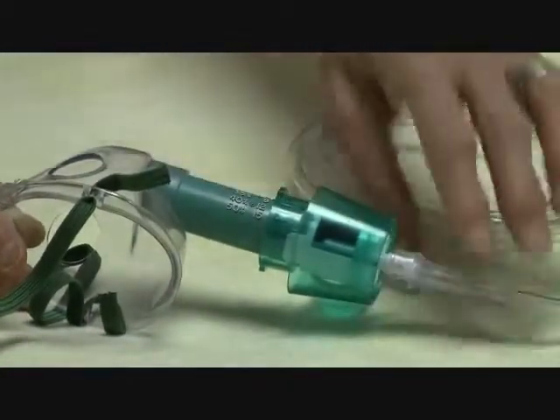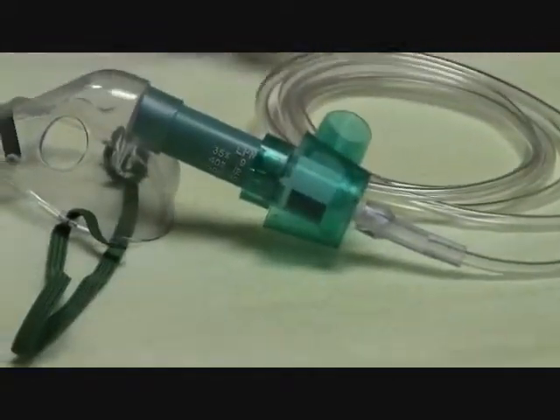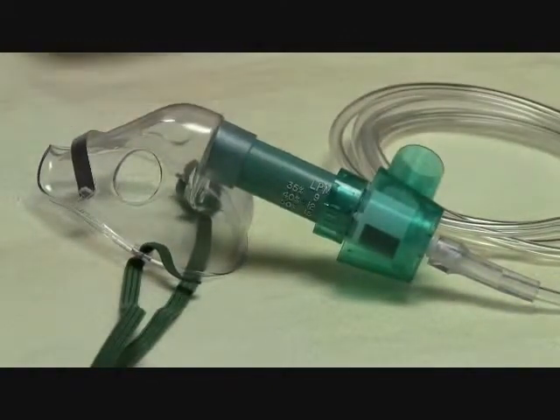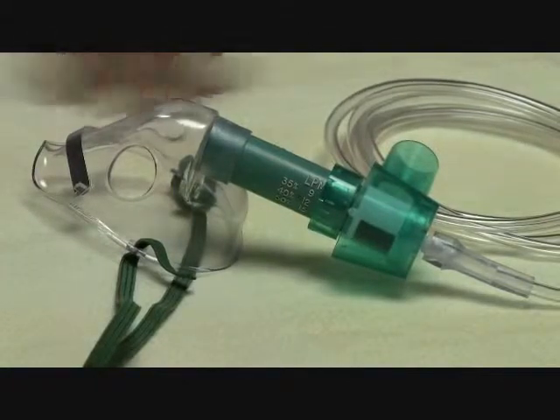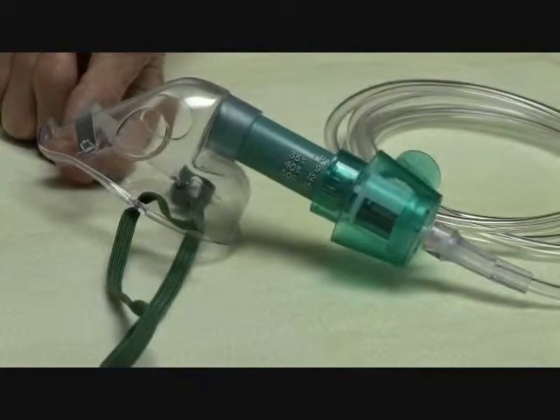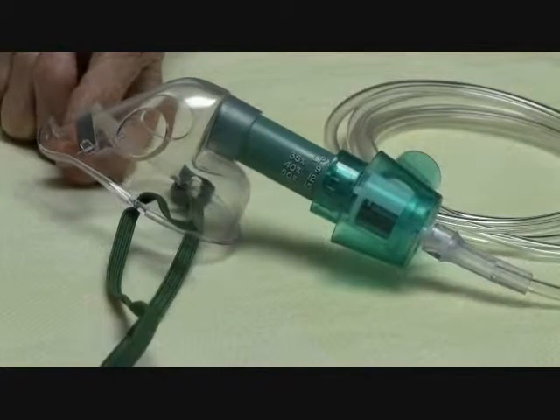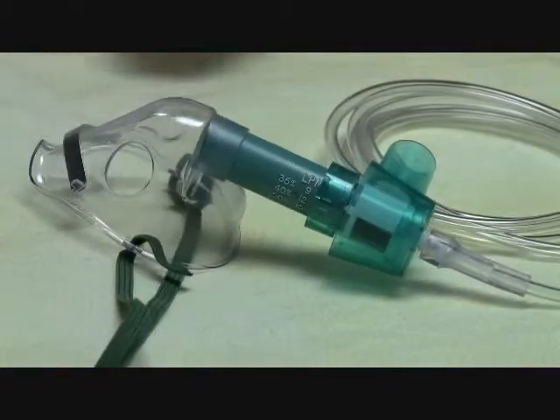Now, one of the benefits also of the Venti mask is that because it delivers that 24 to 50% FiO2, if you have a patient that you're titrating, you're weaning down their oxygen level, you can use this same device to go from 50 to 24%. You can go all the way down to 1 liter nasal cannula using the same oxygen delivery system.